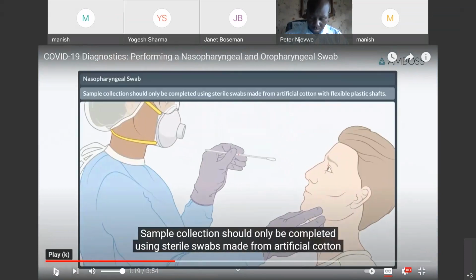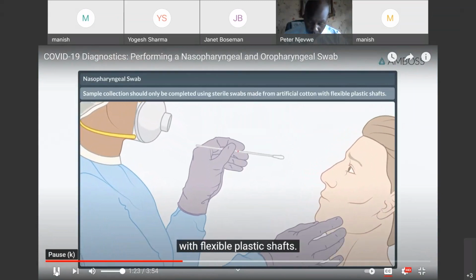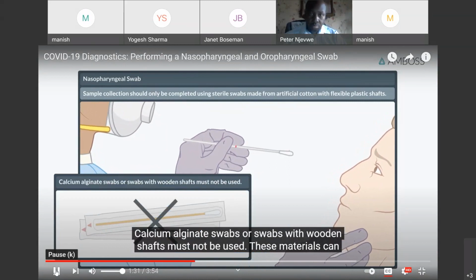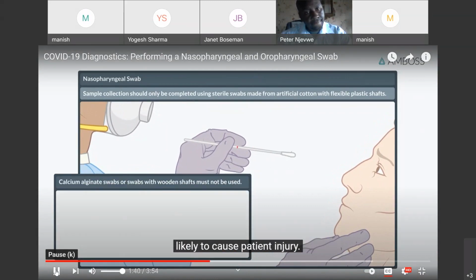Sample collection should only be completed using a sterile swab made from artificial cotton with a flexible plastic shaft. Calcium alginate swabs or swabs with a wooden shaft must not be used. This material can interfere with your test. It may inactivate your viral particles or inhibit the PCR test. Furthermore, wooden shafts are more likely to cause injury to the patient.